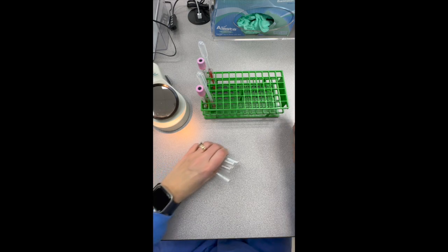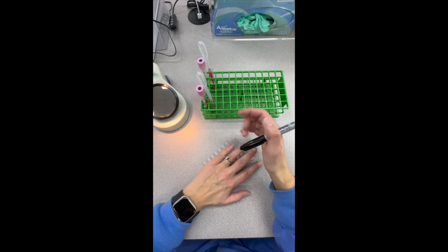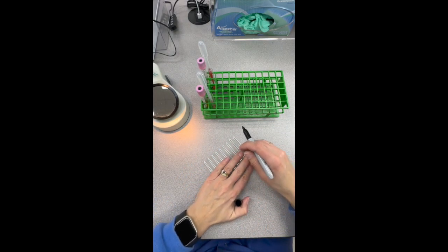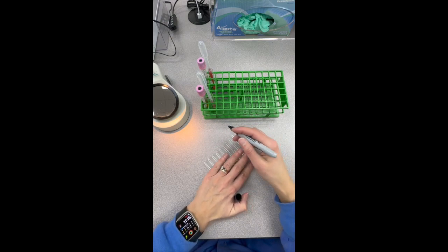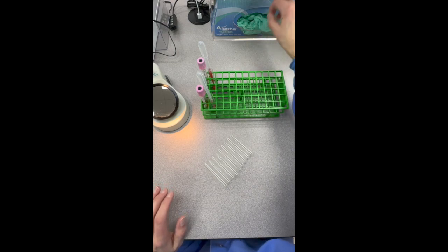Right, so I'm going to label my tubes here, and we're just going to do a regular ABO and RH on these two specimens here. And I have two specimens. Okay, and let me put my gloves on and get ready for this.